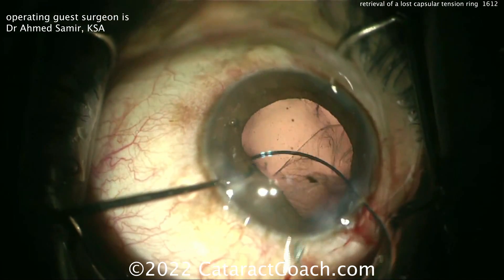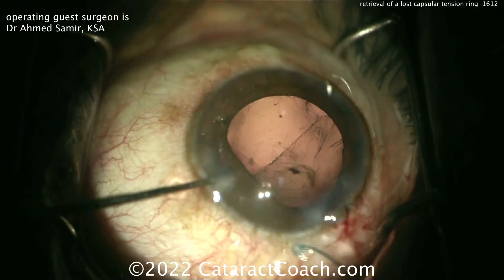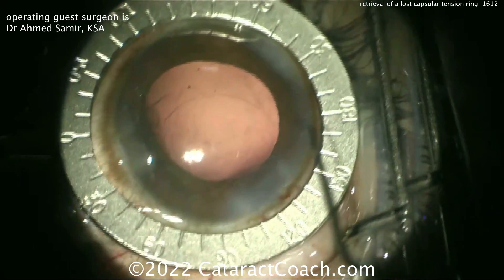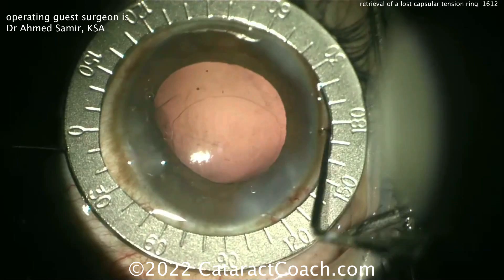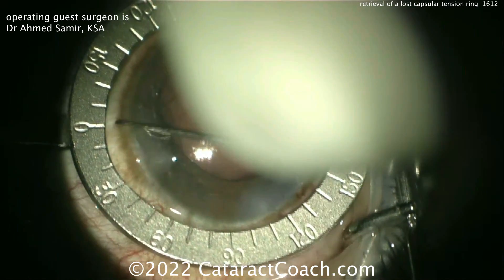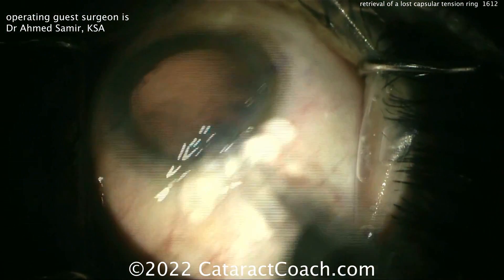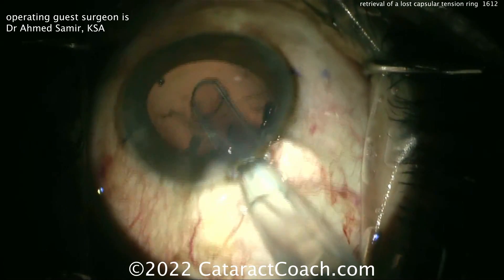Now forceps can be used to extract and remove the CTR from the eye. Much, much better. The last thing you want to see is that CTR floating in the vitreous cavity.